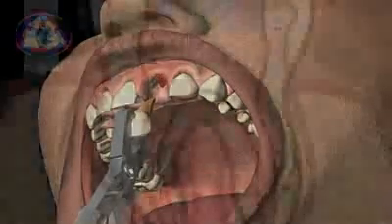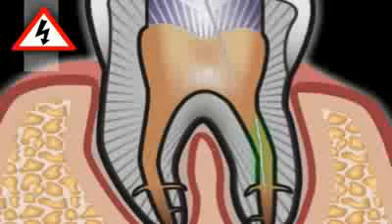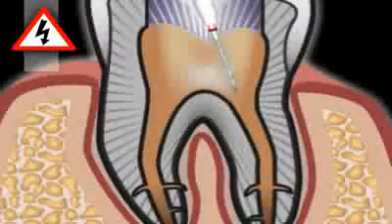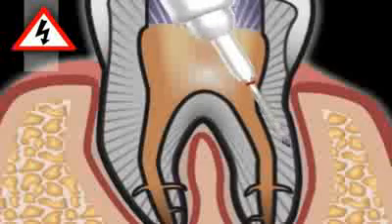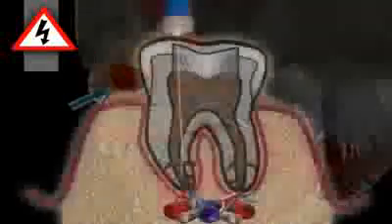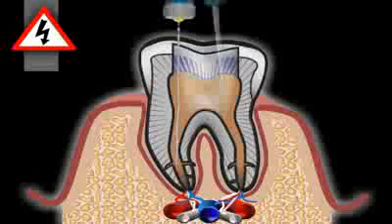The risks associated with a root canal are instruments breaking during root canal treatments, the dentist missing root canals, a perforation of the canal and the dental crown, over-instrumentation with respective possible consequences, such as maxillary sinusitis. You can learn more about possible problems with root canal treatments in the video entitled Complications in Root Canal Treatments.